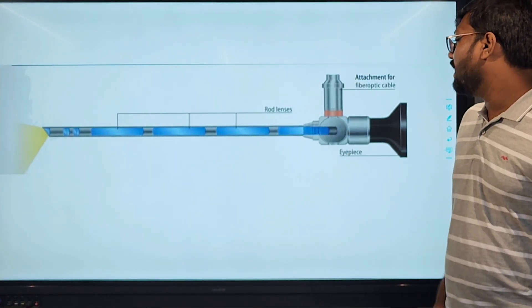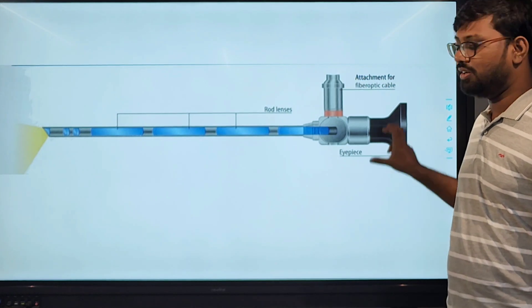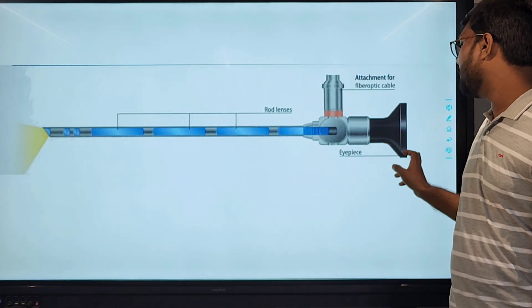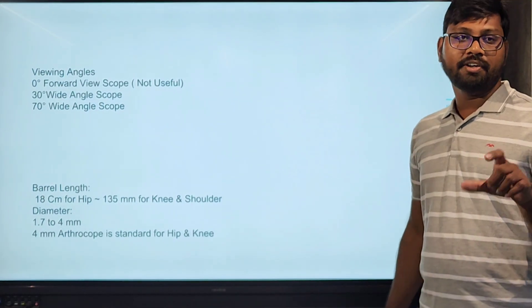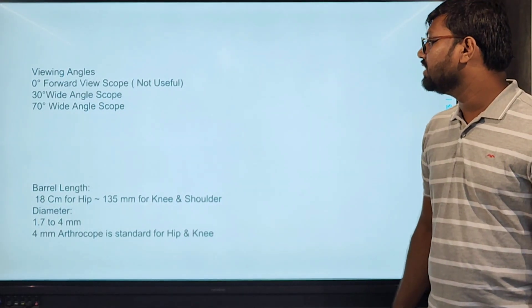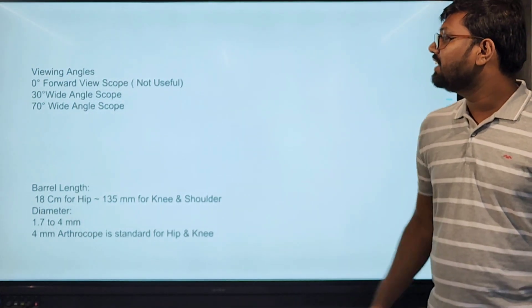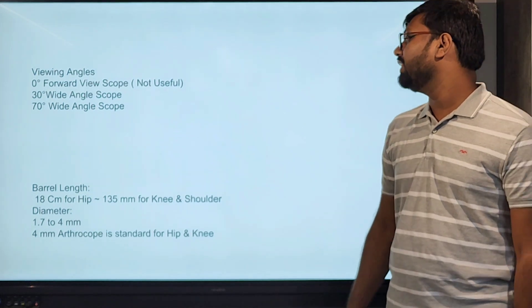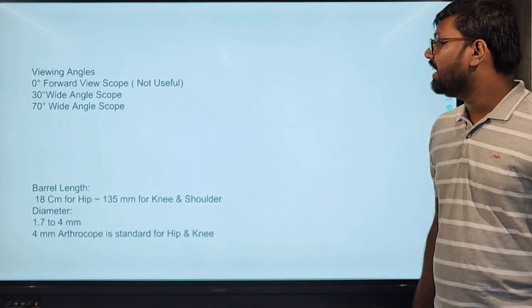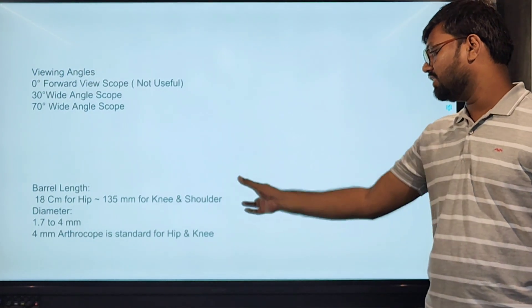This is the arthroscope with the rod lens, attachment for the fiber optic cable, and the attachment for the eyepiece and camera. Regarding viewing angles: 0-degree forward viewing angles are not used as routine for scoping. The 30-degree wide angle scopes are routinely used, and there is also a 70-degree wide angle scope.